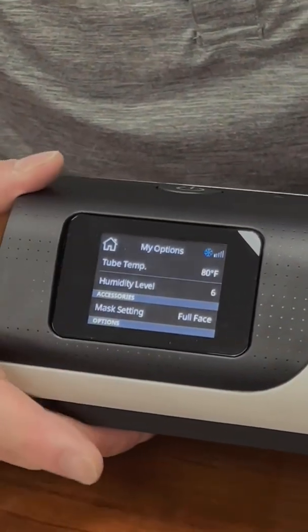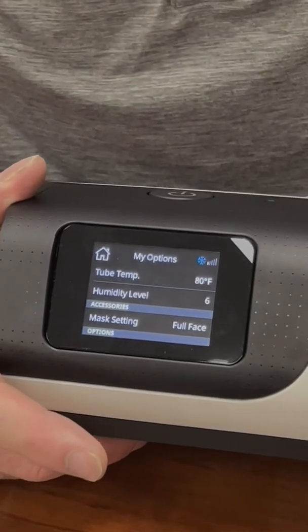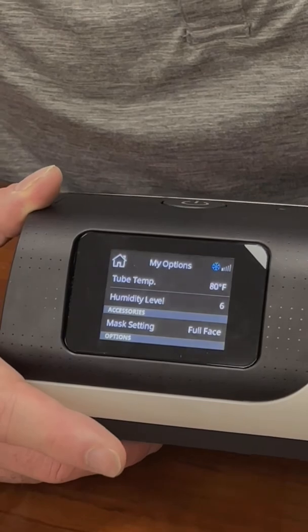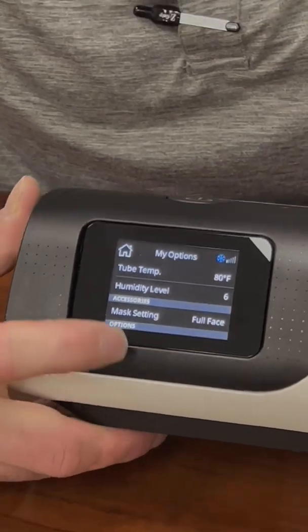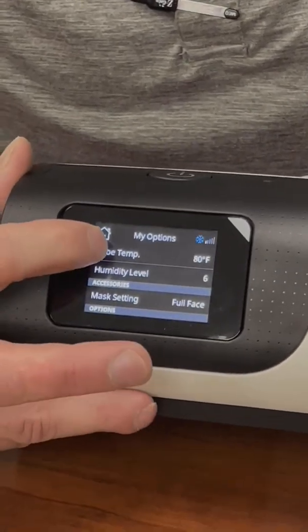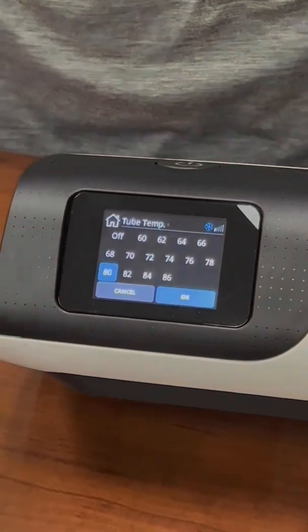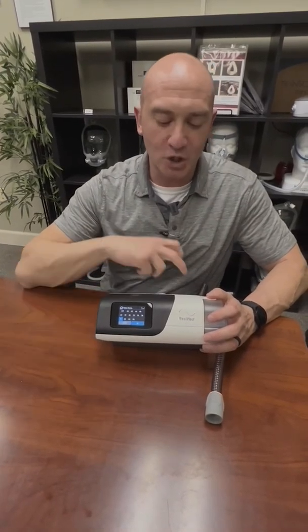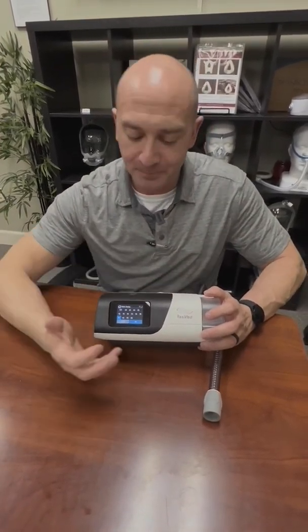Now that humidity level is 0 to 8. So it's a little bit higher than just your base standard coming from the manufacturer. But you also want to adjust that tube temperature. So if you're getting water and droplets in the tubing, you want to increase the tube temperature so you don't get that.